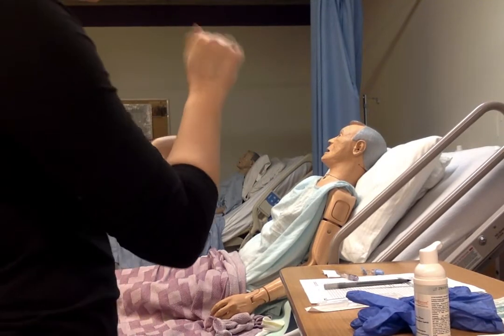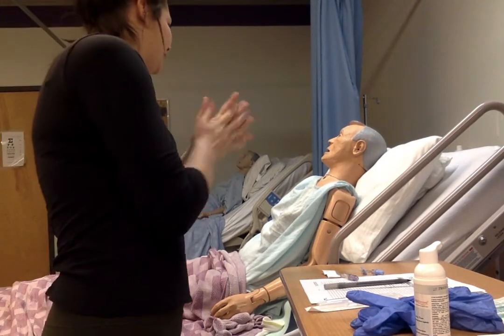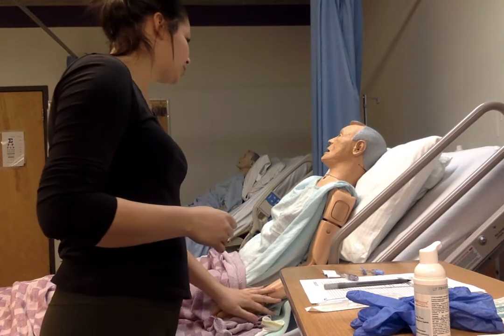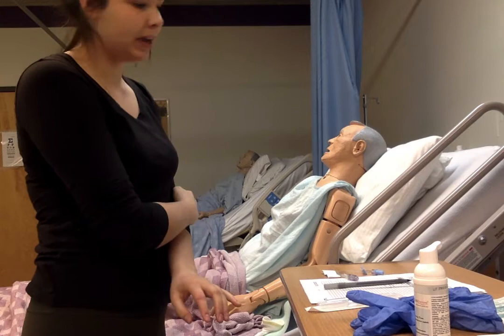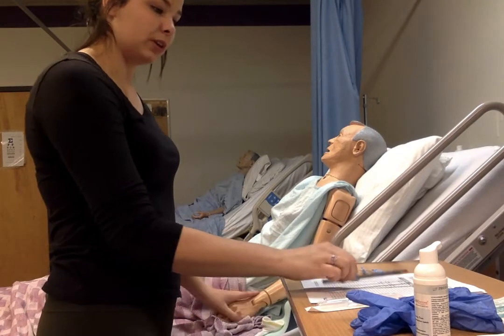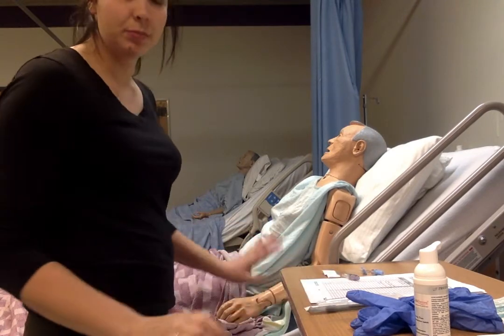All right, so knock, knock, knock. Hello there, Rupinder. It's Kendra. I'm back again. We're going to do your morphine. Can you just tell me your name, please? So he's told me again, Rupinder Appendi, and your date of birth, October 1st, 1982. We still have the same patient.